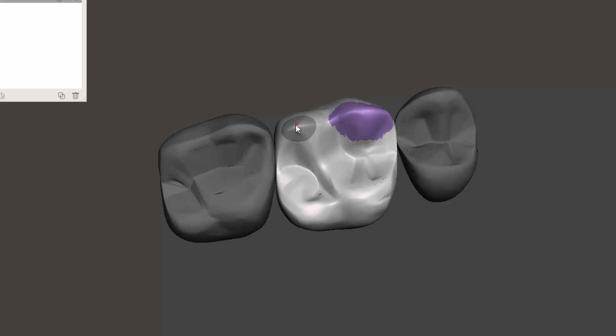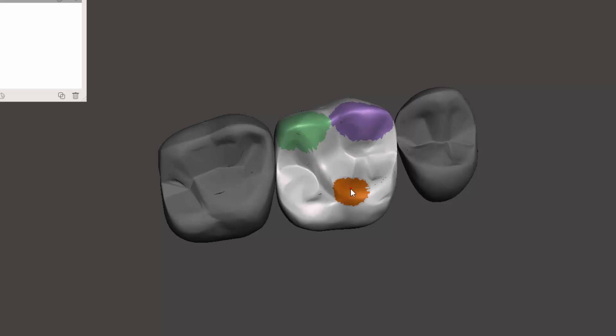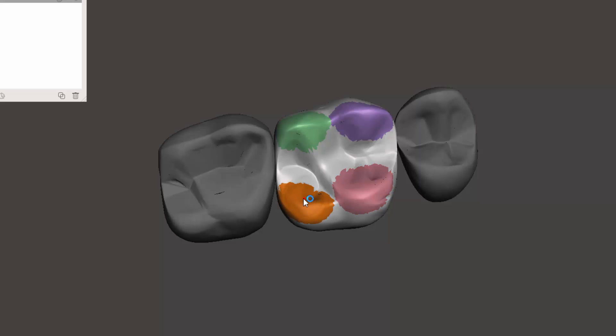Then I can come and highlight this tooth as well, or this cusp as well, and then Control+G. And then select here, Control+G, and then select this cusp as well, Control+G.